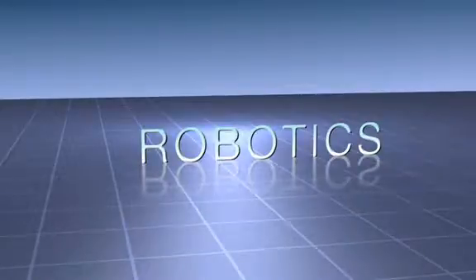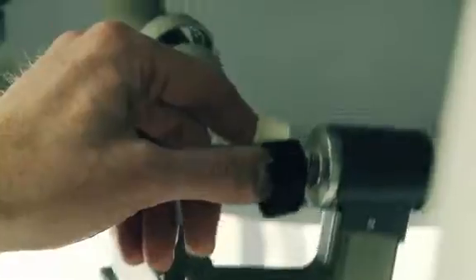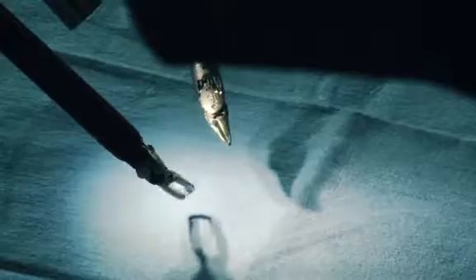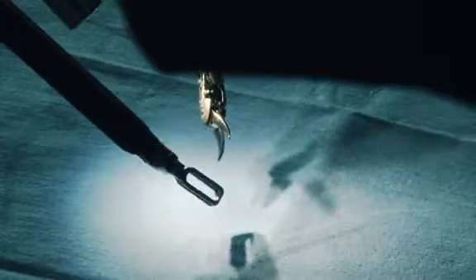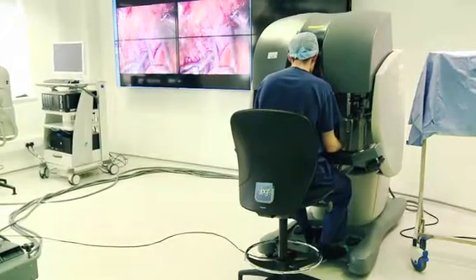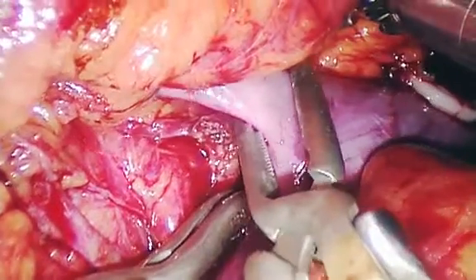Robots, the way we know them, are devices capable of independent activities. They work in car assembly lines, aircraft assembly lines. But in surgery, they are instruments that a surgeon will use to make the surgical procedure much more precise. The real name for it is master-slave manipulator. In other words, the surgeon sits on a master station, and then we have the slave beside the patient, which is the arms. Robotics is one of many tools that we use in keyhole surgery.